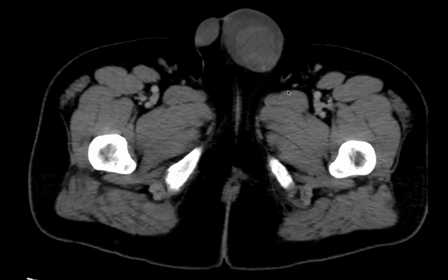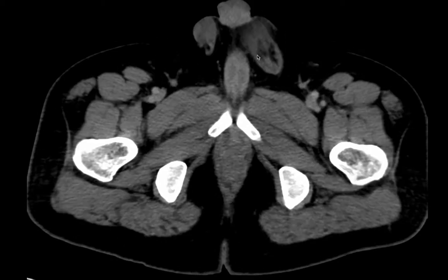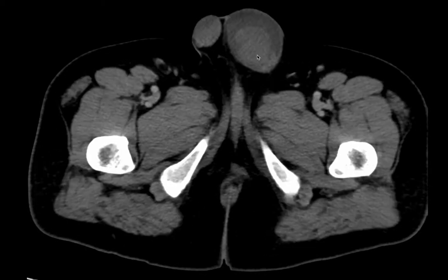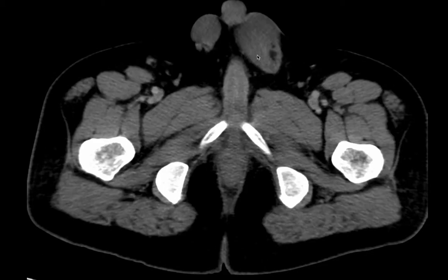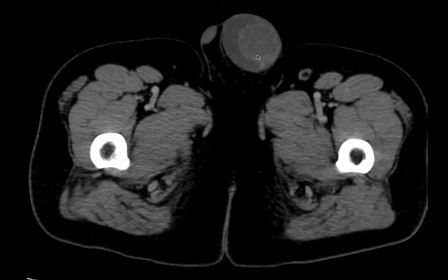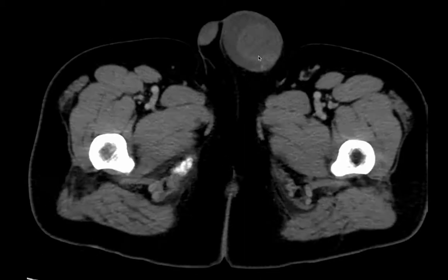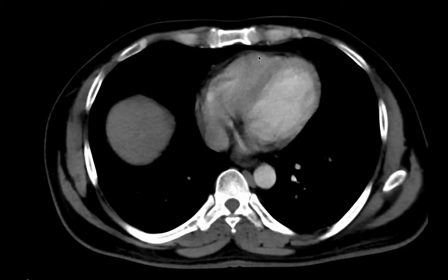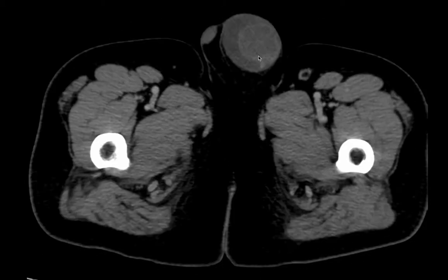The left testis is showing heterogeneous enhancement compared to the right one. Ultrasound of the testis also showed a similar heterogeneous lesion.